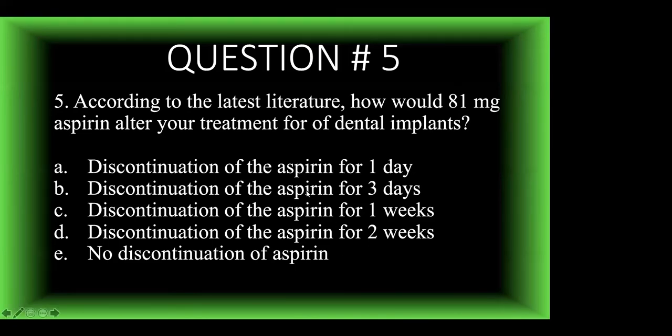And Robert, our results are in. I'm looking for the red. Okay, no discontinuation. 75% did get that correct, and that is the correct answer. Now, why is that the correct answer?